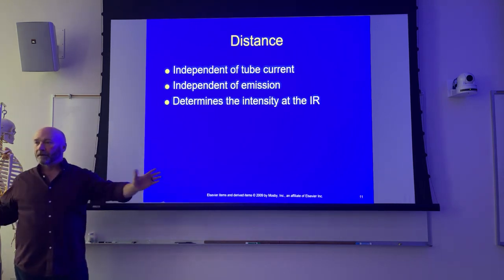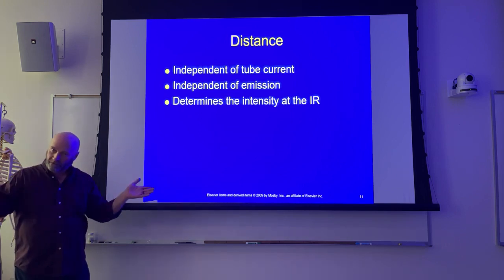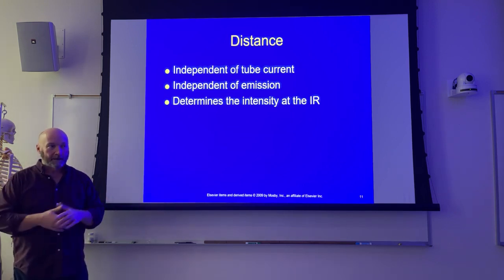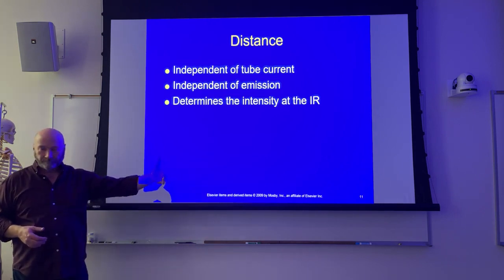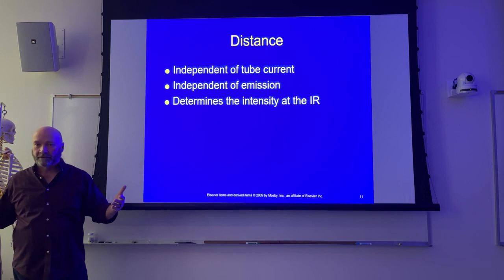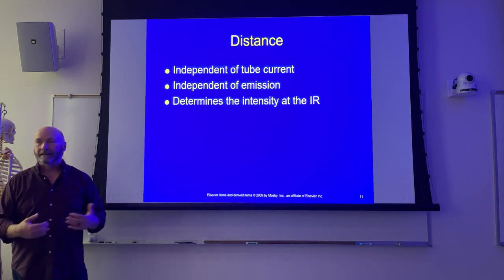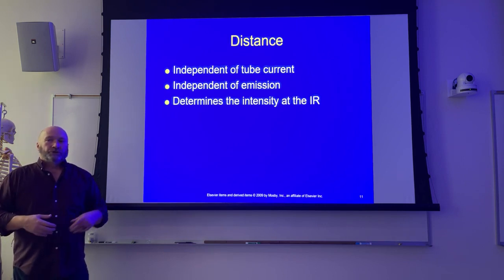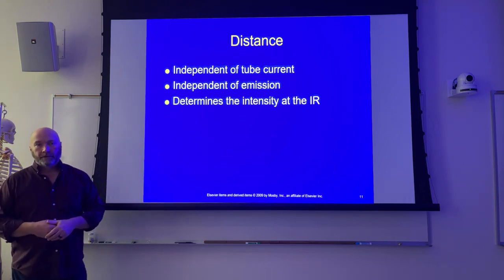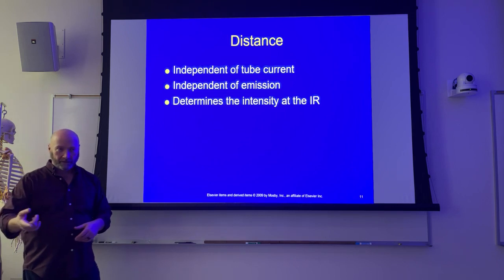So I recommend you shoot AC joints at 72 inches so that the divergence of the central ray isn't quite as bad. Okay? So at 40 inches, you make your exposure, project them off, you back up to 72 inches, and you make a second exposure. You haven't done anything except for make the two exposures. Did anything happen with the X-ray tube? The answer is no. That's assuming that you set your technique though, okay?